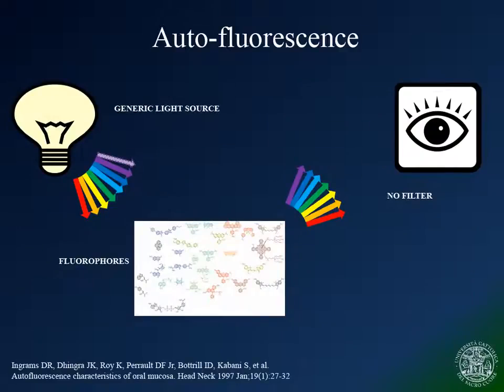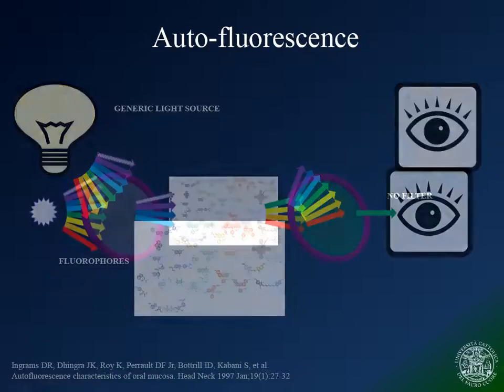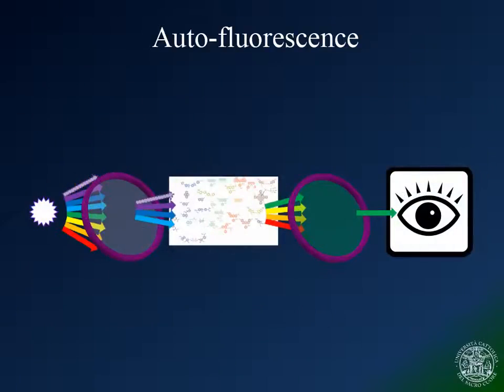This happens because some molecules that we call fluorophores absorb certain components of the light charging energy. This energy is then transferred in the form of a soft fluorescence. Using optical devices, it is possible to see this pale light and even select the light emitted by fluorophores that provide diagnostically relevant data.